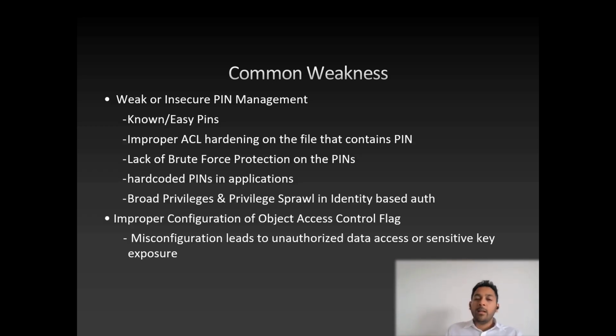If it's stored improperly, without proper ACL hardening on that file, then any application or even an unauthenticated user can access this pin and access the objects in the slot. So you need to make sure you have proper ACL hardening on the file that saves this pin on the Linux side.